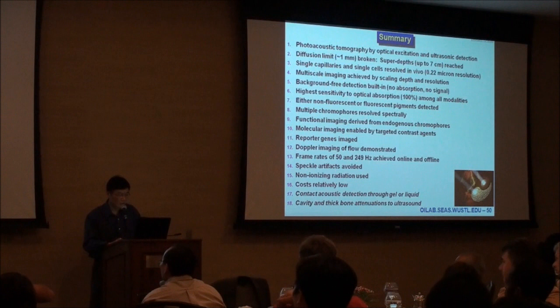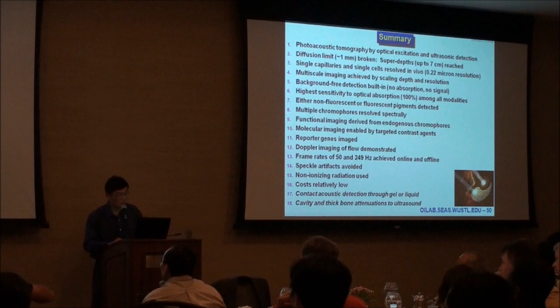Cavities and very thick bones attenuate the ultrasound. And so we are imaging through the skull, but the human skull is even thicker. So we actually got signals, so we think there's high hope there.